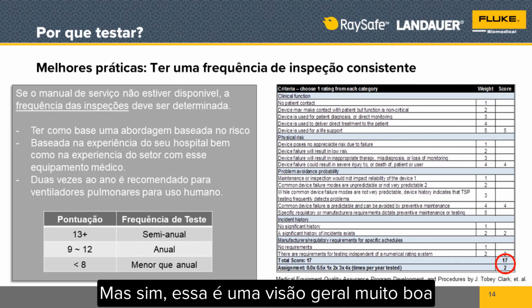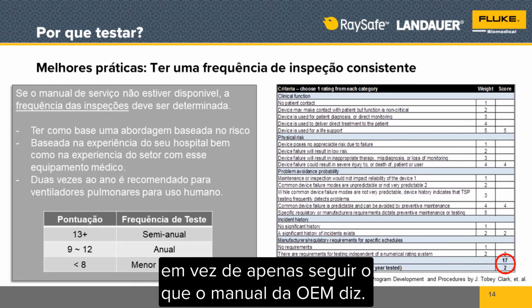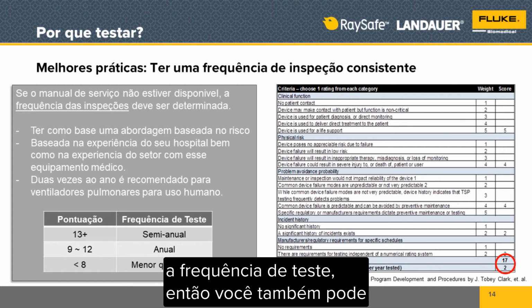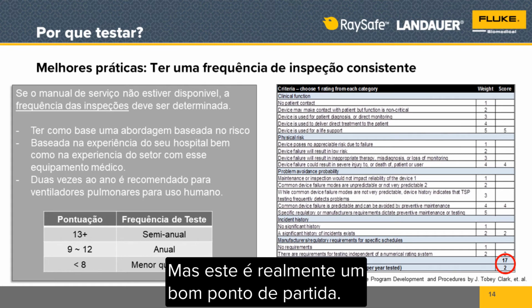But yeah, this is a really good overarching view of how test frequency could be determined rather than just following what the OEM service manual says. Sometimes it doesn't state it at all. So if it's not stated, the test frequency, then you might as well start here and then adjust going forward. But this is a really good starting point.